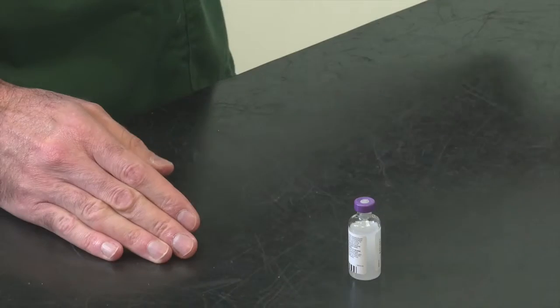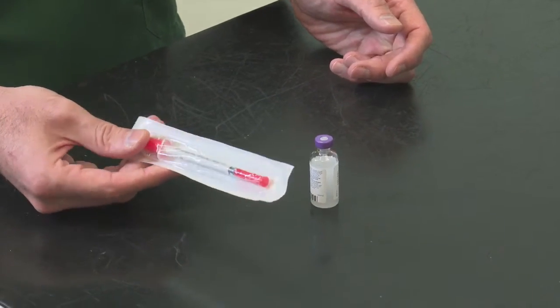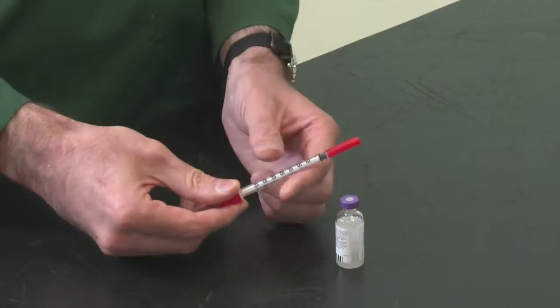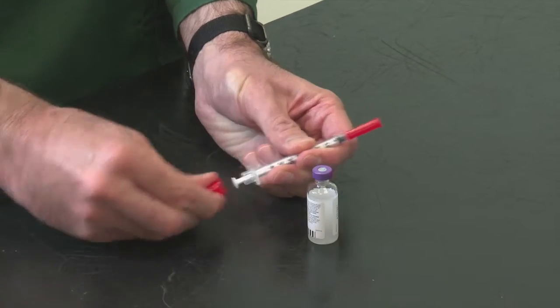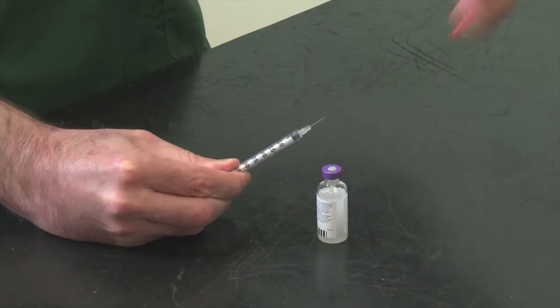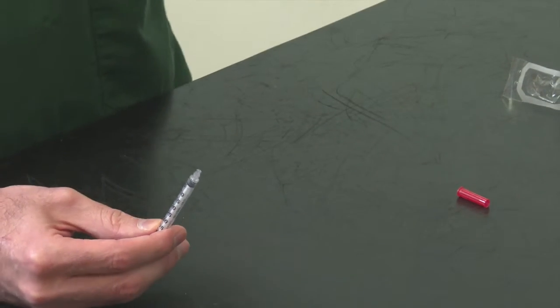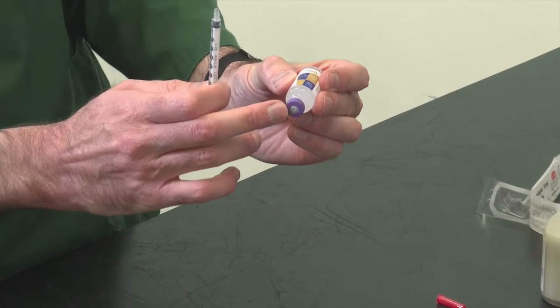The next step is to draw up the insulin. You are going to have a syringe, probably a 1ml syringe or smaller. This is a 1ml insulin syringe, so I am just going to peel it out of the pack. You will notice that it has two covers — one at the plunger end and one at the needle end. We take off both covers, the plunger end first followed by the needle end. Make sure you don't prick yourself. We hold the bottle vertically and insert the needle into the little bullseye at the centre of the bung.